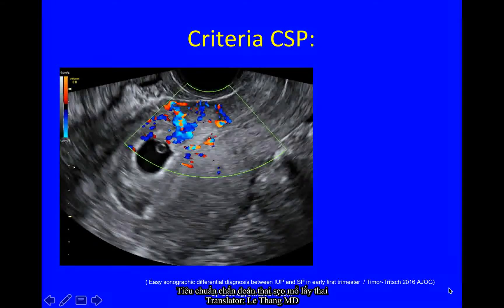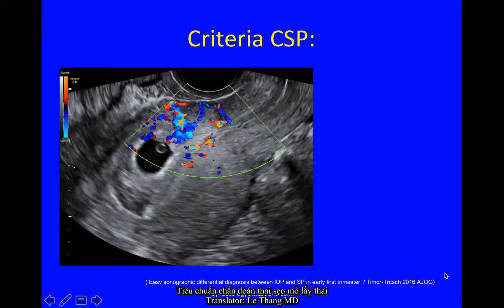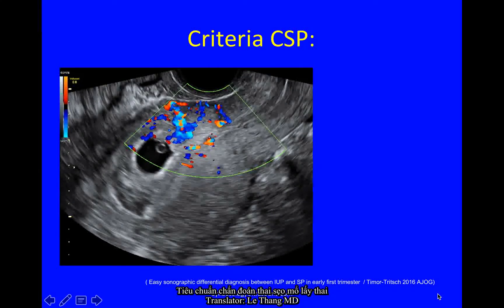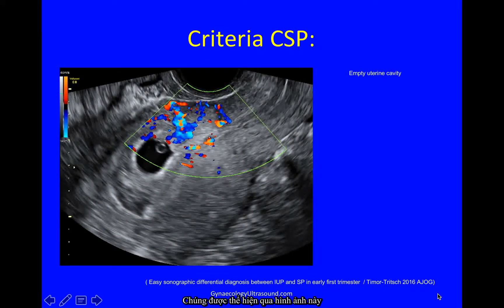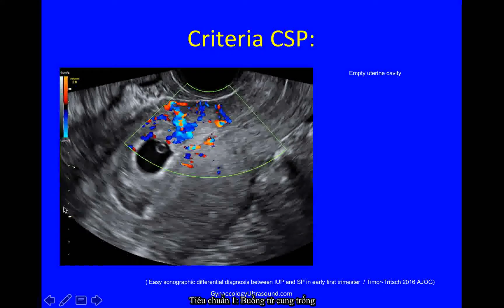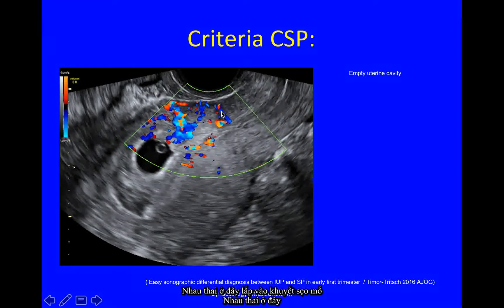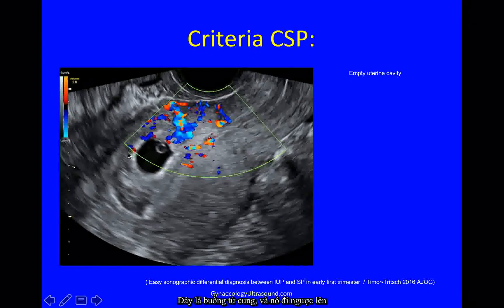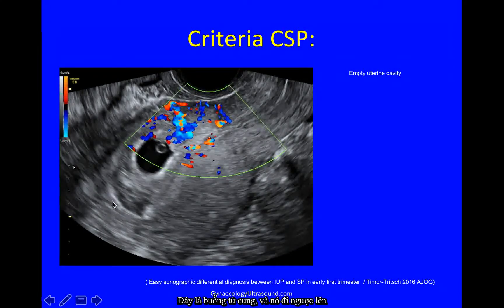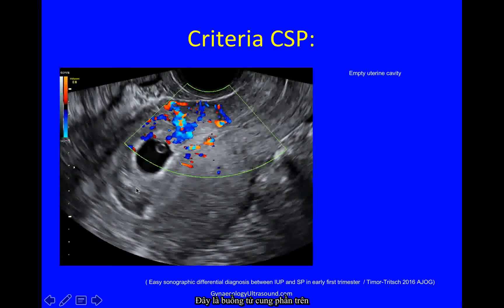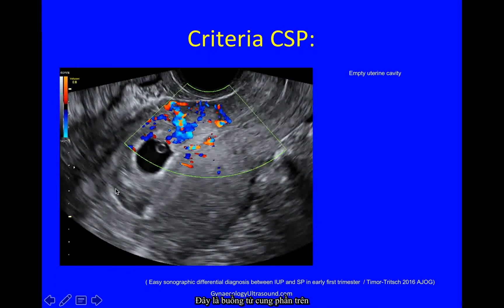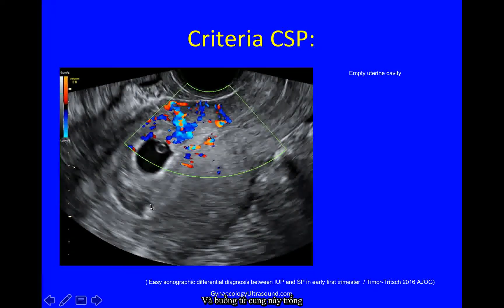Cesarean scar pregnancy is again confirmed in this paper and demonstrated in this image. This is an anteverted uterus with an empty uterine cavity. You can see the cervical canal, then trophoblast up here into the niche. The endometrial cavity is here and goes back up, so you can see the upper uterine cavity is empty.